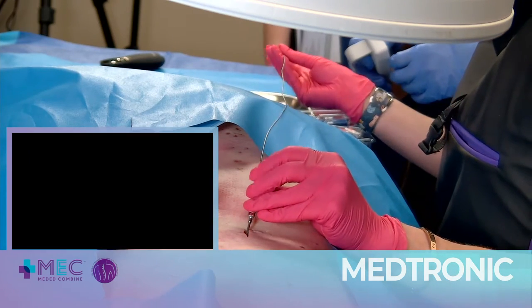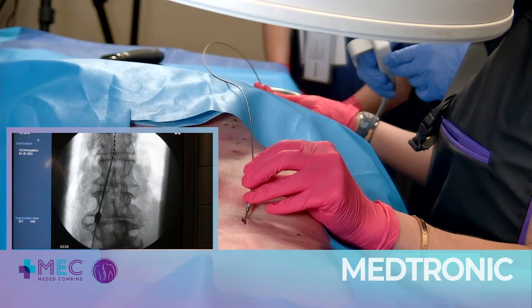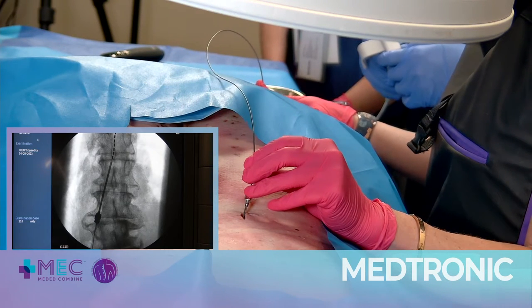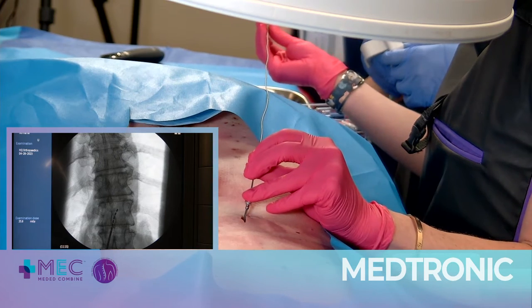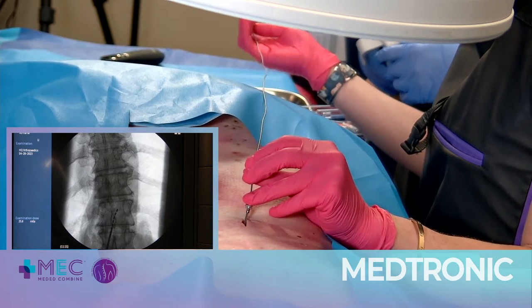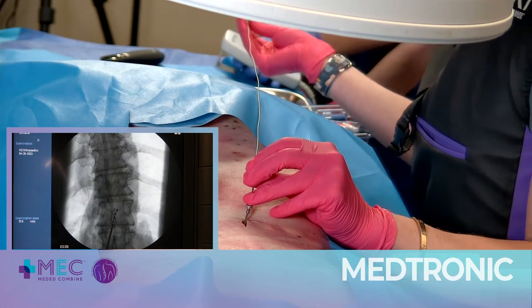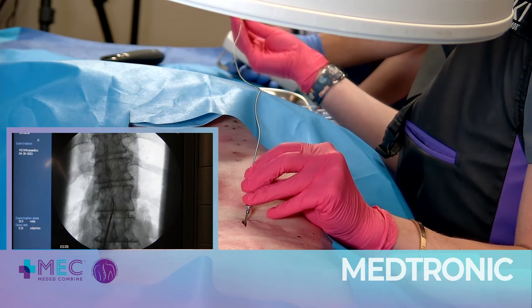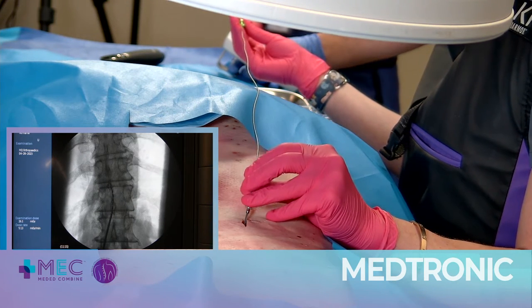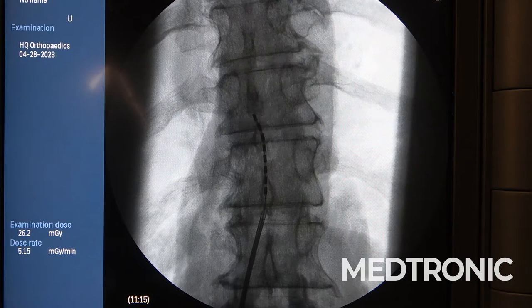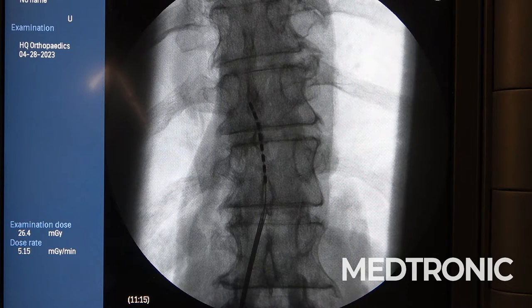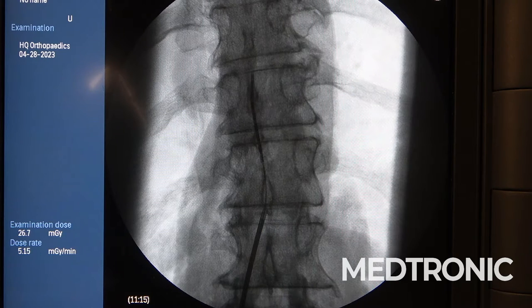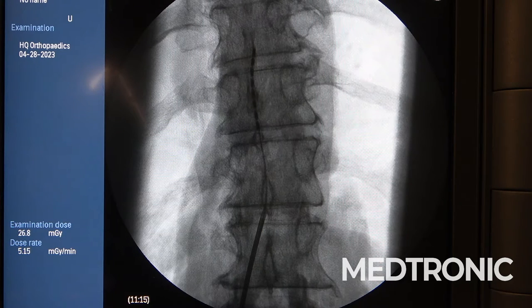Steering is really imperative and you do have two different options. I'm twisting this from the back with my rear hand — the front hand is only feeding, that's all it's doing.